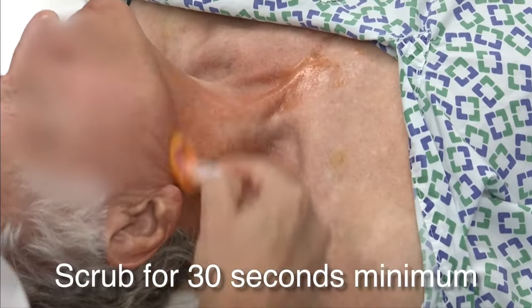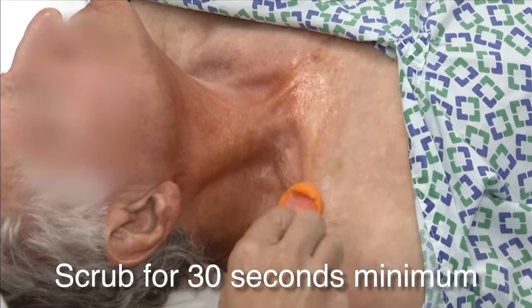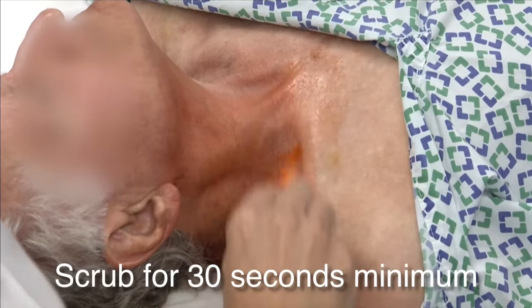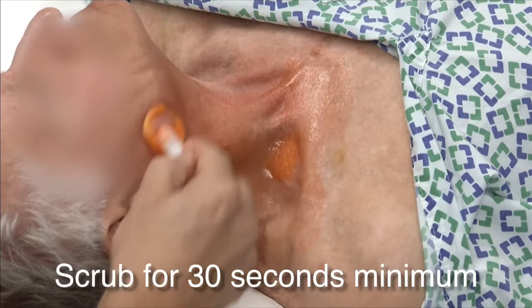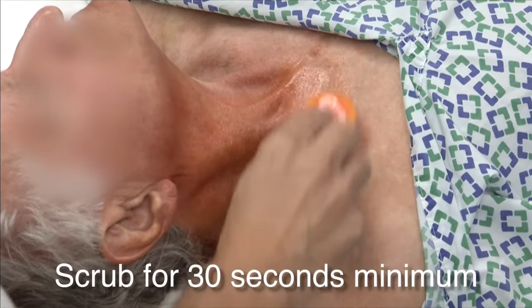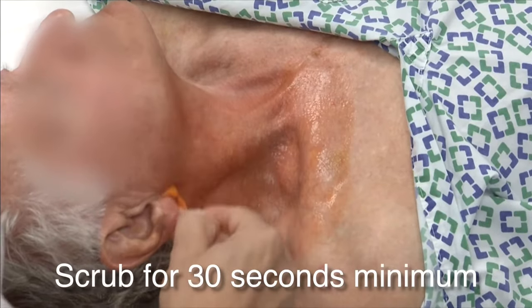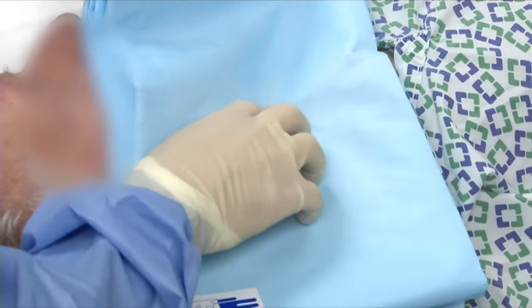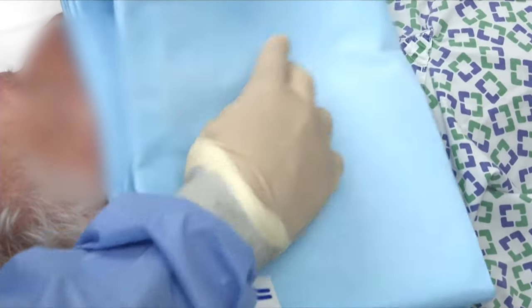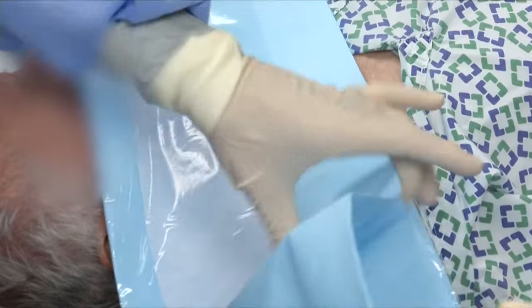Next, scrub the skin around the procedure site with chlorhexidine gluconate solution for a minimum of 30 seconds to ensure a sterile field. Once this is complete, the procedure site may be draped to ensure maintenance of a sterile working field.